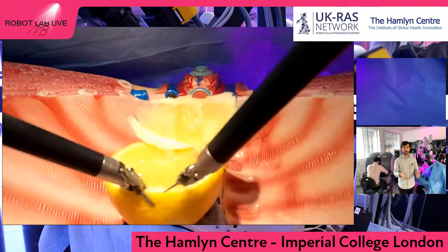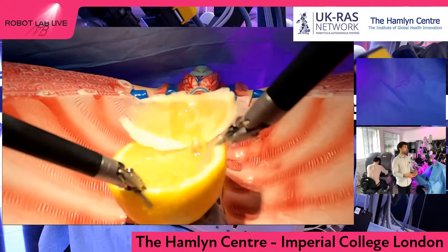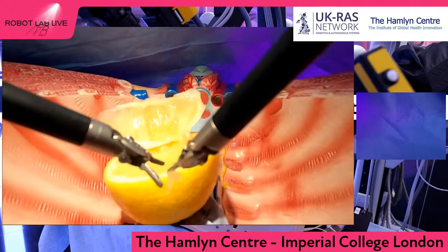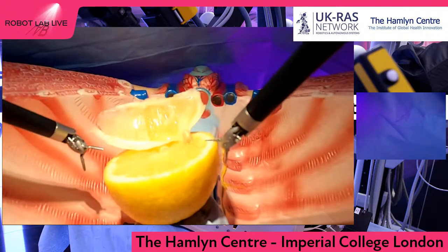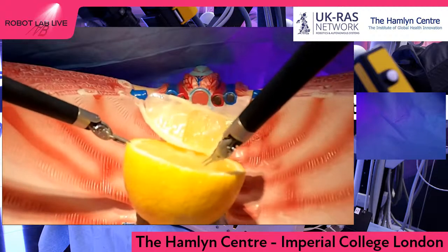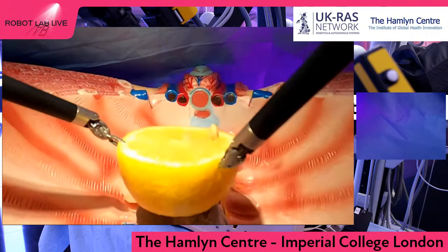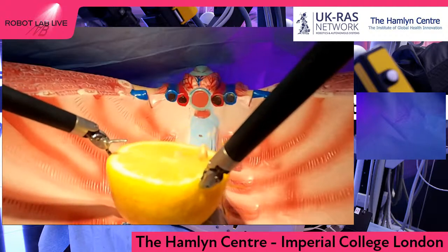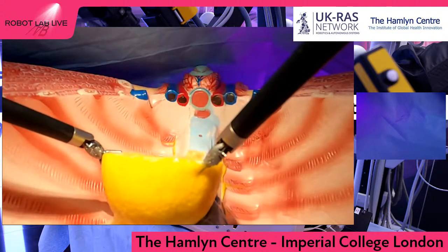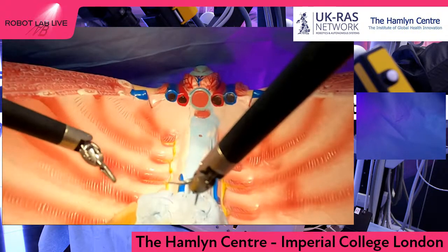And the first thing would be how to teach the body movement. And as you can appreciate, the lemon doesn't move. Well, it moves if we push it away, but it doesn't have any inherent movement. And if you think about yourself and you put your hand over your chest, you can see that your heart is beating, you are breathing, and your lungs are expanding. Those movements are easy for us to understand, but when it comes to teaching the robot, it becomes a bit more complex. So in that line, we have some research that is trying to understand how tissue and organs move and try to teach that to the robot.